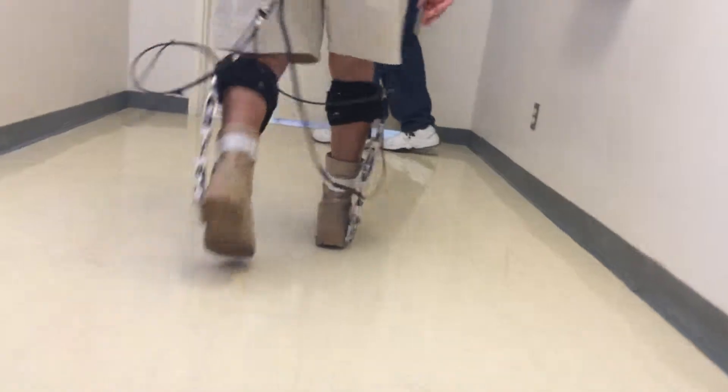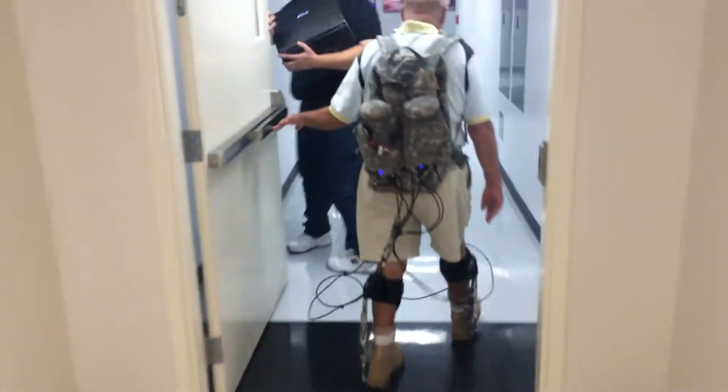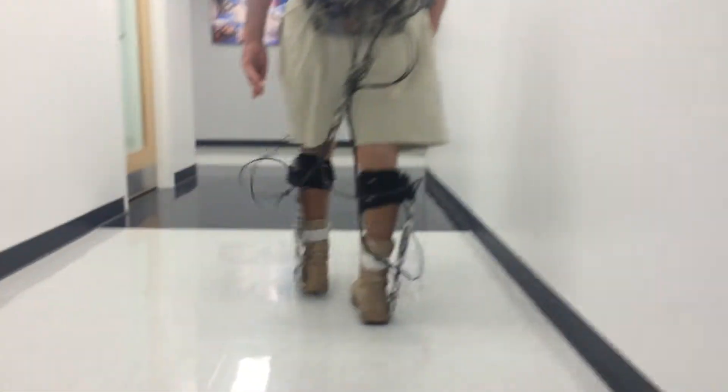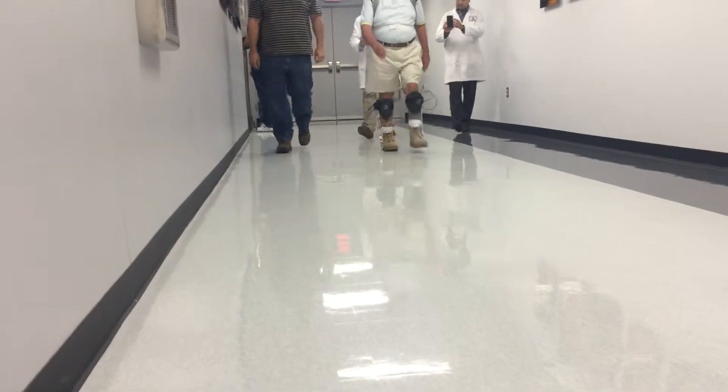You can see here that there's a lot of wires and this cumbersome backpack hanging off of the guy, but they hope to make a smaller form factor pretty soon. These wires would all be embedded within the device or within the exoskeleton sleeves, and the backpack and battery life is going to continue to improve.